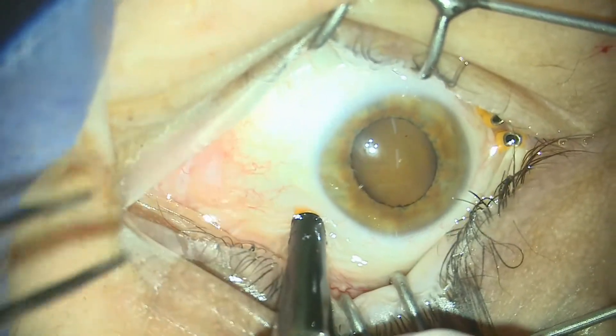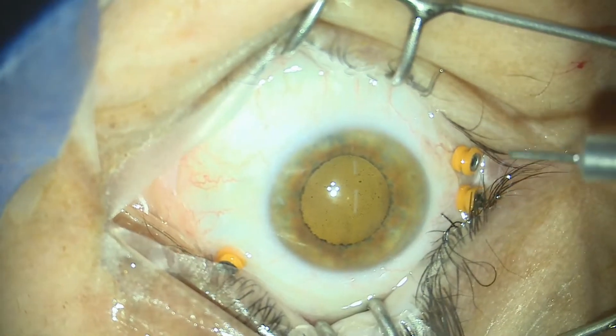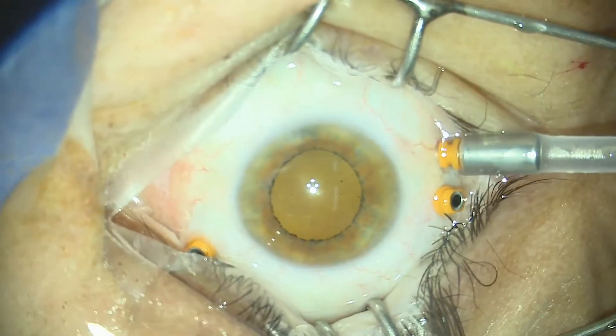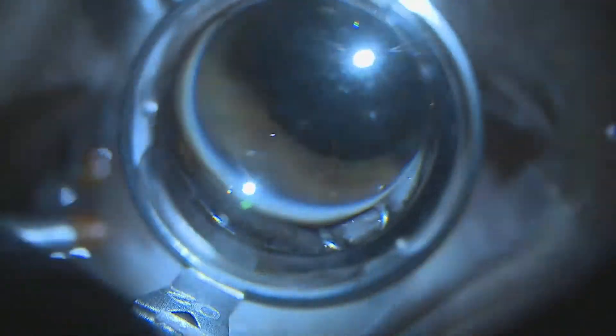Welcome! We are now in the SEMA Institutional Educational Retina. I am Dr. Daniel Maduro, your host. Today we are going to watch a surgery without editing. It's a type 1 proliferative diabetic retinopathy with extension proliferation of fibro-vascular tissue on the posterior pole and equator, treated with pan-retinal photocoagulation. I am presenting with a tractional retinal detachment and vitreous hemorrhage.